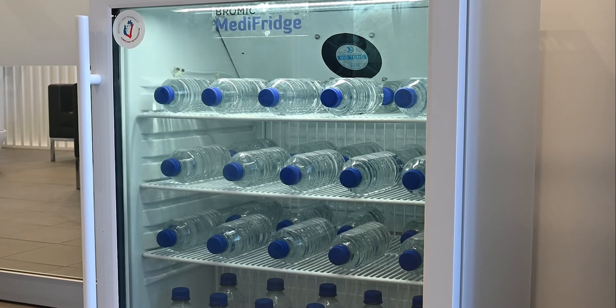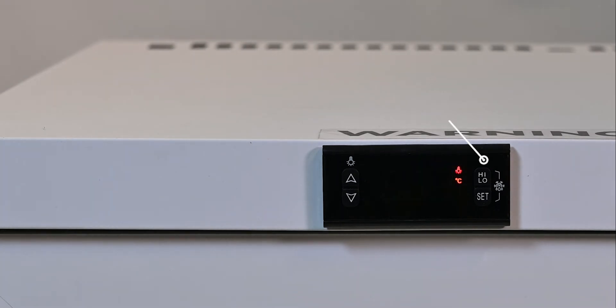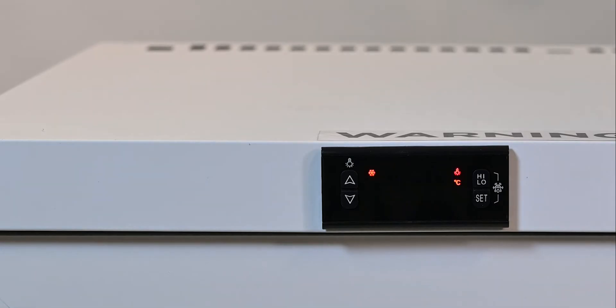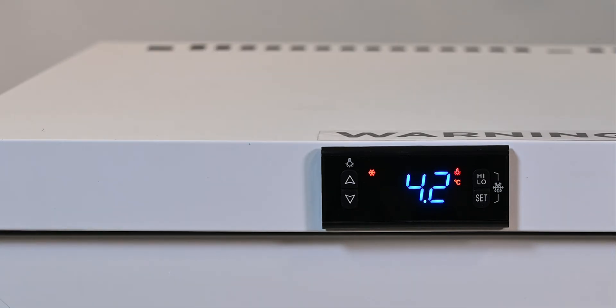Checking the maximum and minimum temperatures on the Med0140GD. To display the maximum temperature, press the high-low button once. To display the minimum temperature, press the high-low button again while the maximum temperature is showing — the minimum temperature will then be displayed. To reset the maximum and minimum recorded temperatures, hold the high-low button for 6 seconds. The display will flash for 3 seconds and an audible noise will be heard. The new maximum and minimum temperatures will be recorded from this point until the next reset.